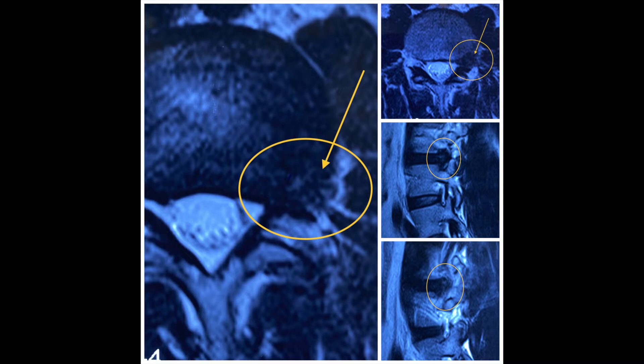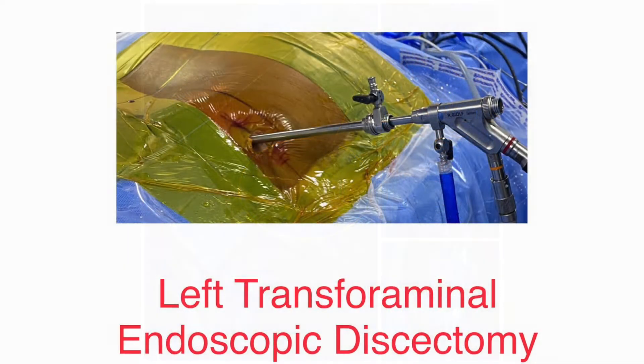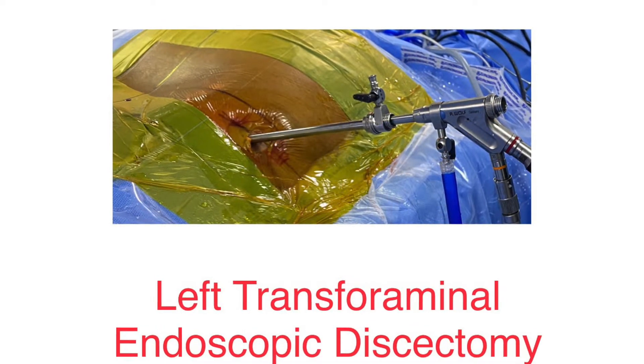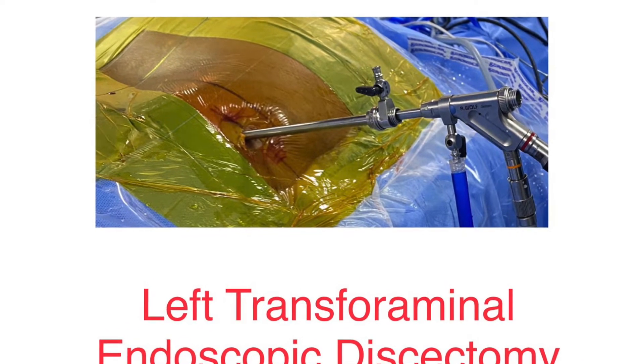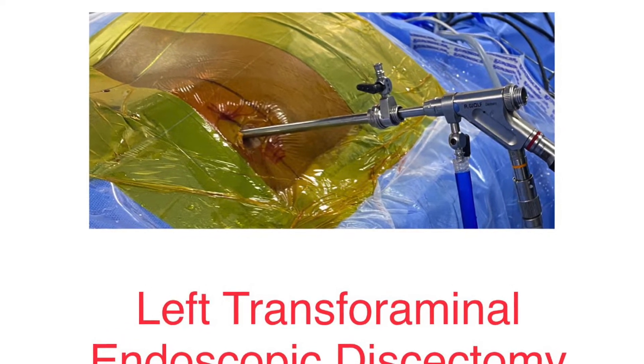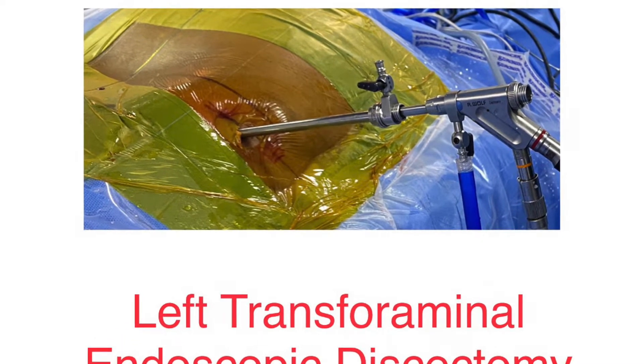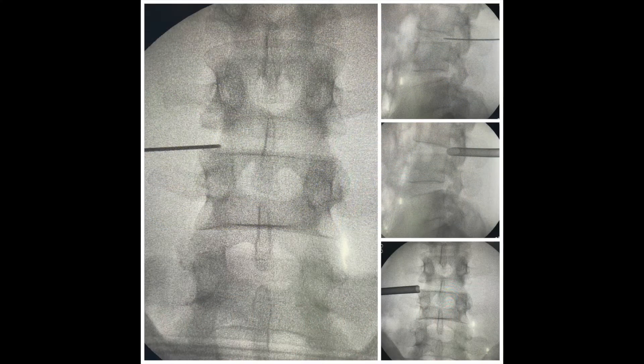30-year male with severe left L3 radiculopathy, MRI showing left foraminal and extra-foraminal disc prolapse. Left transforaminal endoscopic discectomy was performed with the patient in prone position with epidural analgesia.